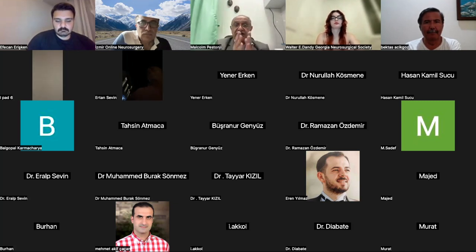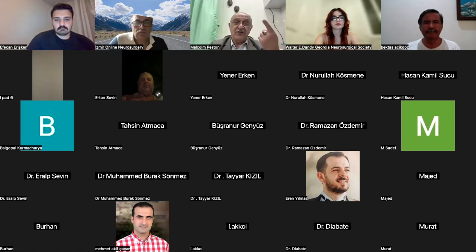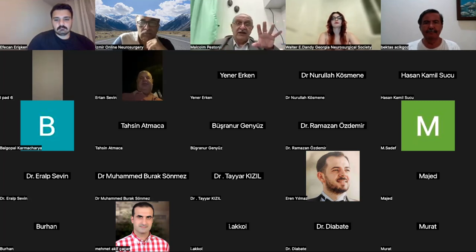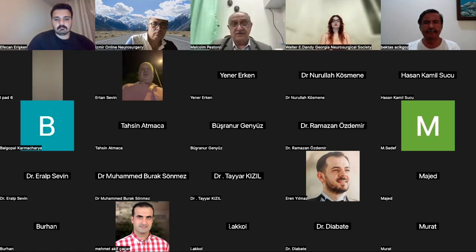So therefore, a 30-degree scope is a must in Para-UBE and in ipsilateral cutting, even in ICLF, because you want to see down and into the opposite foramen. So therefore, these are the indications for a 30-degree scope. That's why we spoke initially of the advantage of learning with a 30-degree scope, because switching your mental acuity between images of 0-degree and 30-degree every time is a nuisance. So I teach my children to learn 30-degree.